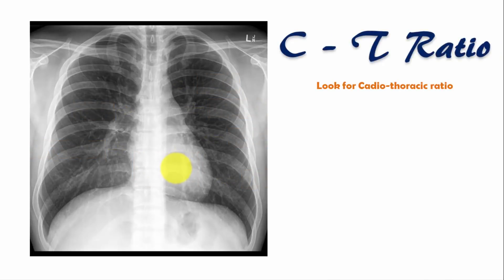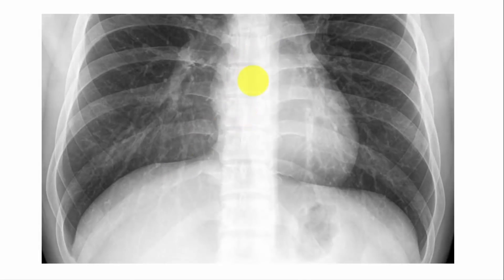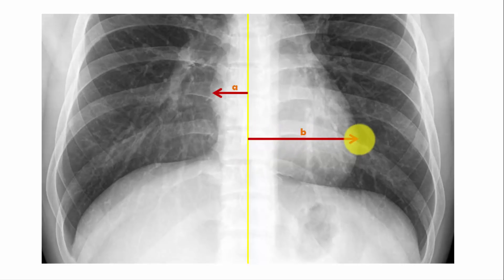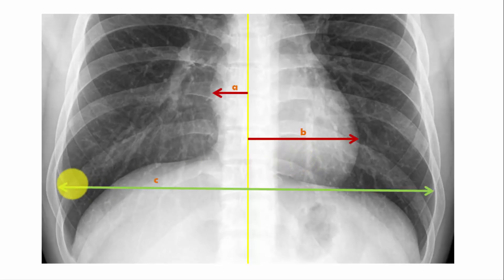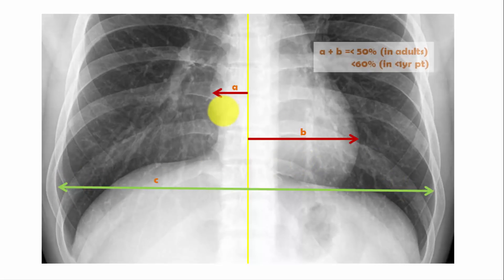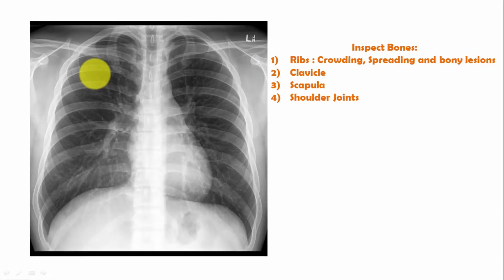Next, comment on the cardiothoracic (CT) ratio. Draw a perpendicular line along the spinous processes of the vertebrae. Draw line A perpendicular to this central line toward the maximum width on the right side of the heart, and line B toward the maximum width on the left side. Compare A plus B with line C, the maximum width of the thoracic cavity. Normally A plus B should be less than 50% in adults and less than 60% in infants — if greater, it may indicate cardiomegaly.